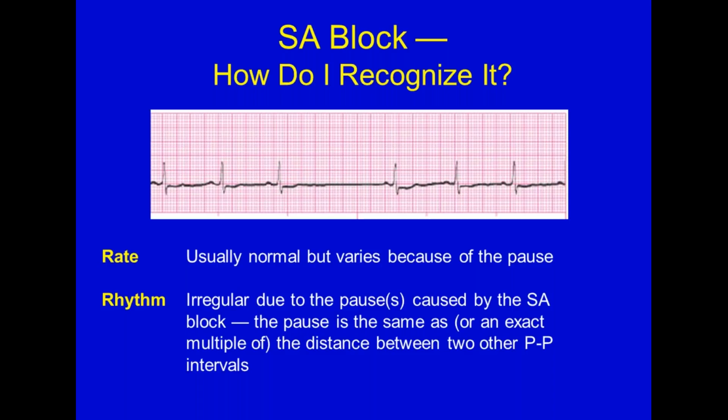So we may or may not even see these, and that's the real issue with a lot of these rhythms we're going to come across in this book. I'll bet out of the 24 of us, counting myself, one or two of us will never see some of these things. I know there's some in there that I haven't seen.